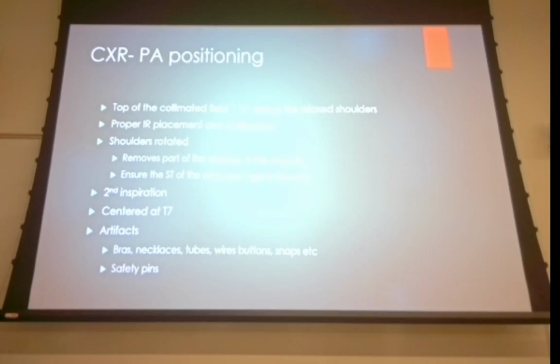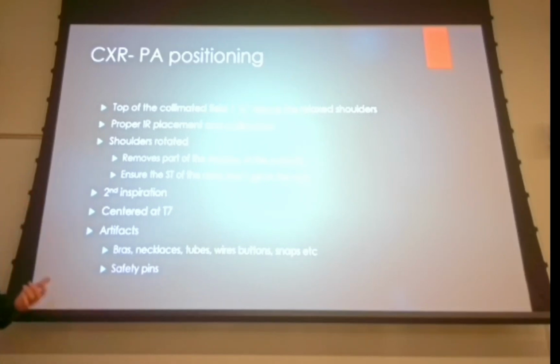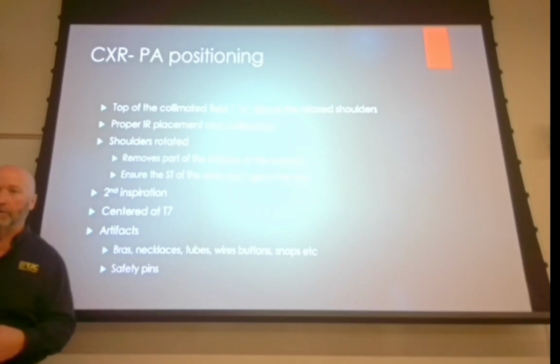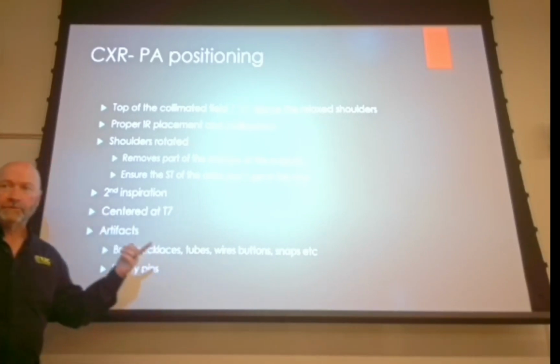So 1.5 inches above the relaxed shoulders, and I point out the relaxed shoulders because some of your patients, and the demographic here is usually small, thin, little old men, walk around with their shoulders arched up, right? Some of you have seen these, the patients walk around with their shoulders up. So make sure that you get their shoulders relaxed, and then 1.5 inches above the outer portion of the shoulder. Don't forget to rotate your shoulders forward.